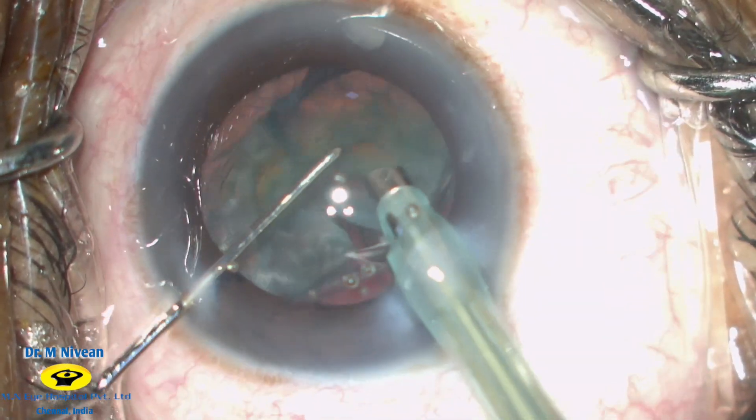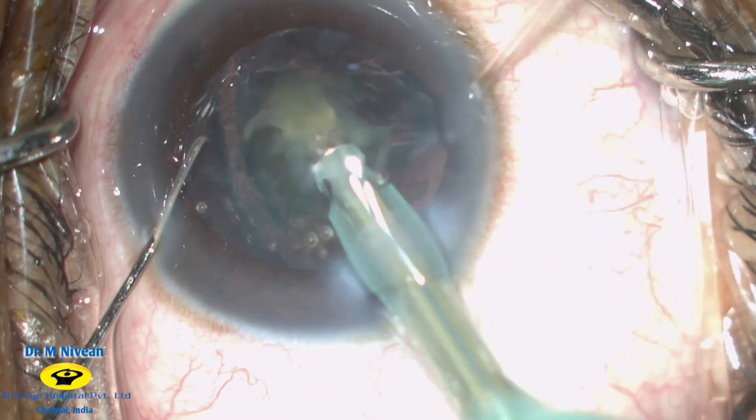As you can notice, a very good followability is achieved because of a tight wound construction.